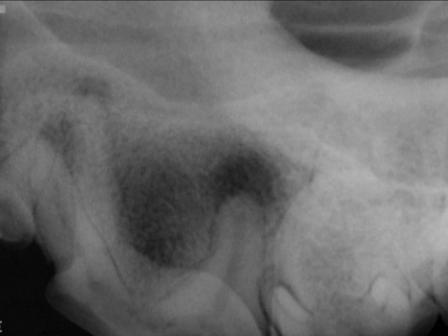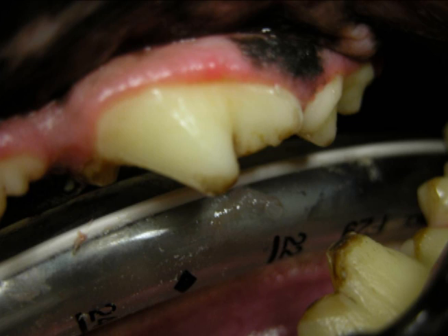Here is an example of a tooth which has become abscessed secondary to an uncomplicated crown fracture. Note that there is minimal damage to the tooth. However, the tooth is severely infected. All fractured teeth, no matter how small, need to be radiographed and treated.